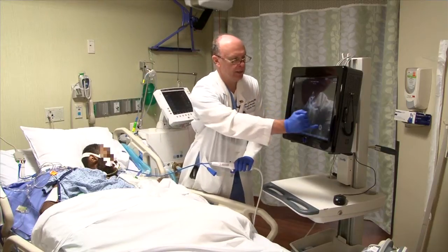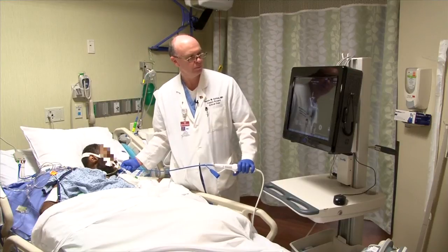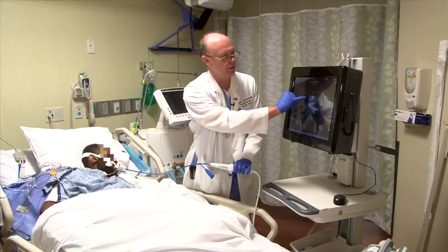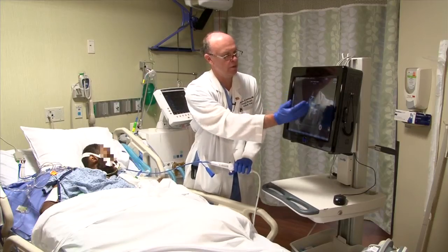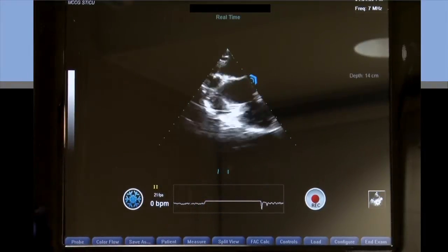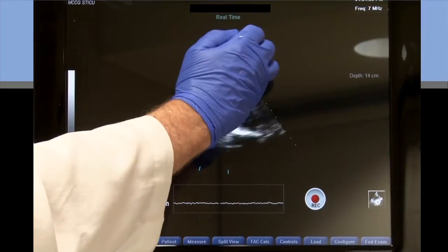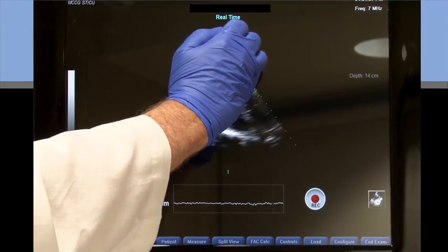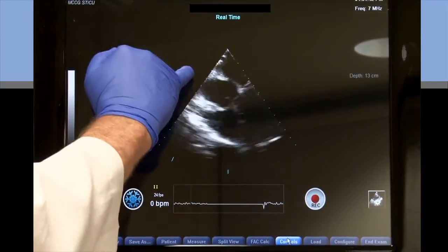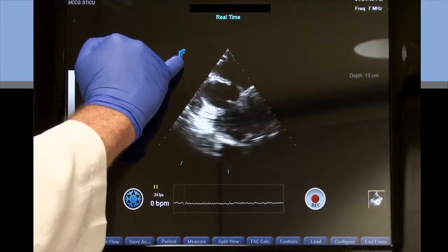I'm going to optimize again by hitting the optimization button, which will change my gain and give me the best picture. I can also electronically change the position of the image if it's to one side or the other on the screen. I can rotate it by tapping the side of the screen — a blue arrow comes up and I can tap that blue arrow to swing the image.